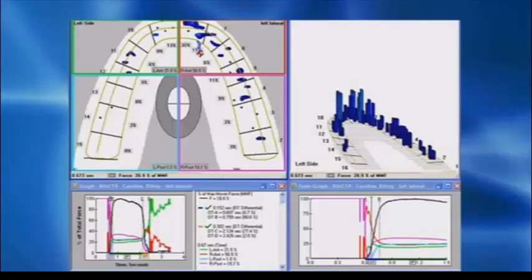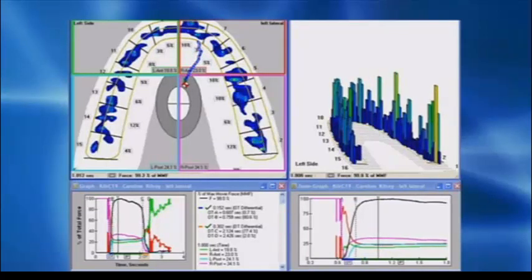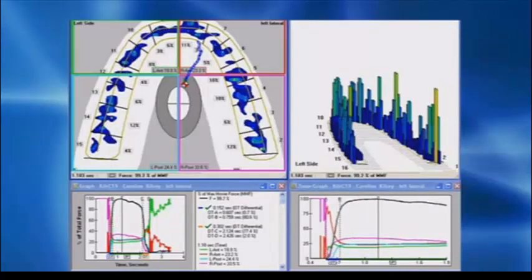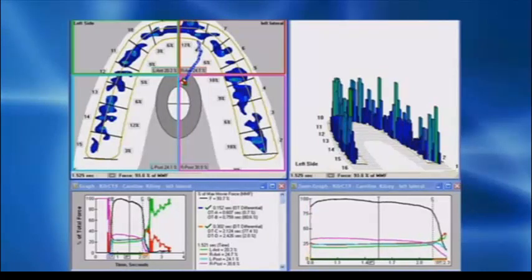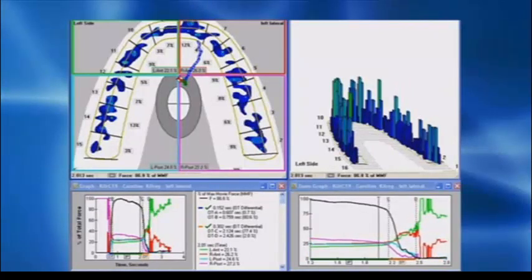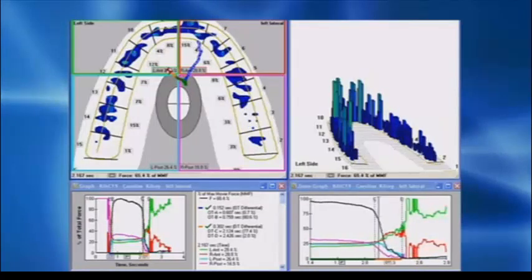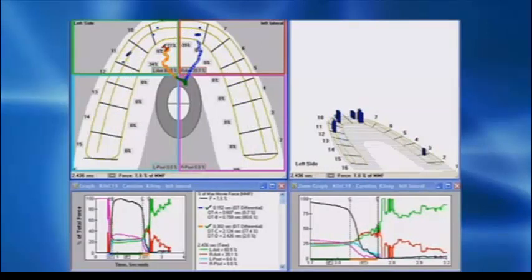Let's look at the left. On the left, you see the same kind of slightly right-sided center of force, although it comes right to the middle, or almost the middle, which is good, overall balance when you close. Now when you slide going left, this is a significant improvement over pre-treatment. Now both sides disengage. You have a little bit of drag on the left side, not too much. Total time 0.3 of a second. So that's actually an ideal endpoint, less than 0.4 of a second. So the left side is pretty good, as I would like it to be. The right side needs an improvement.